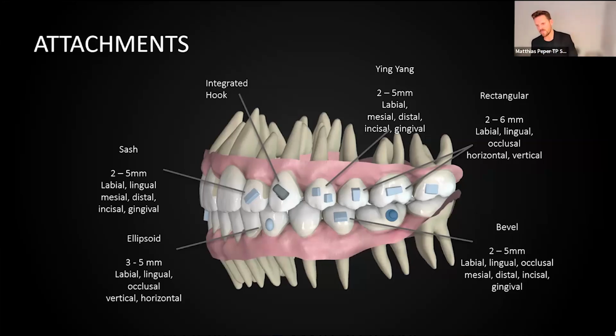Why is it so beautiful with Spark? Because if we do treatment planning with Spark, we don't need to change any attachments for 90% of the cases. So they are calculated by the software in a perfect way. We don't have optimized attachments. These are all passive attachments.